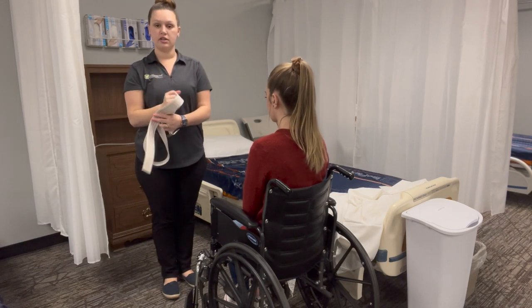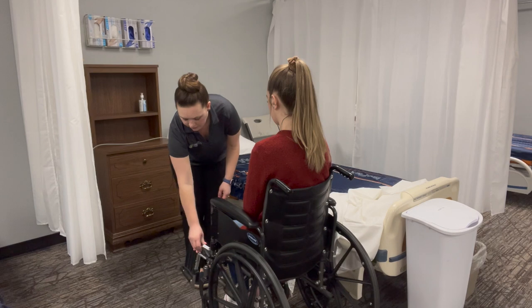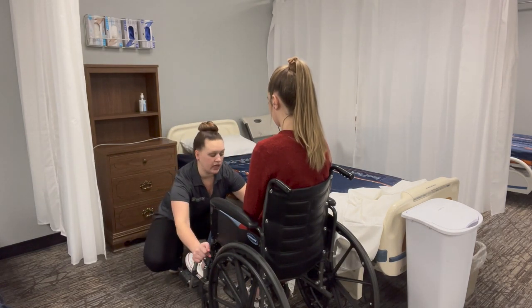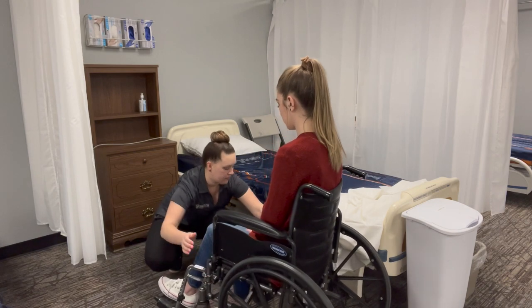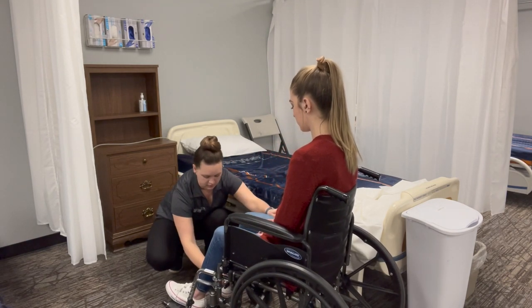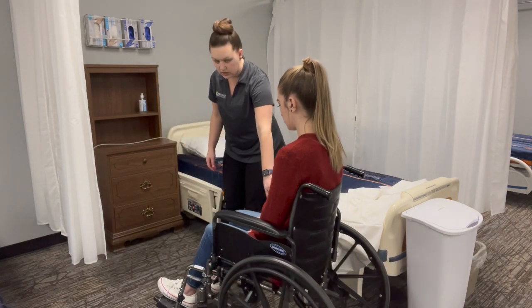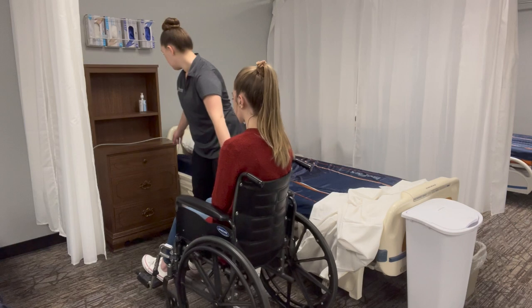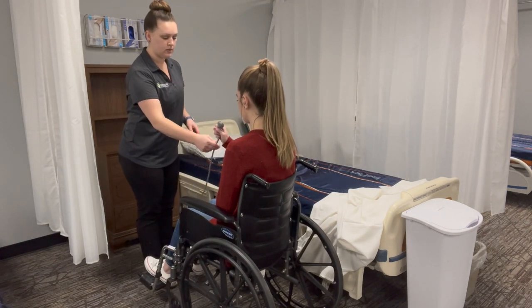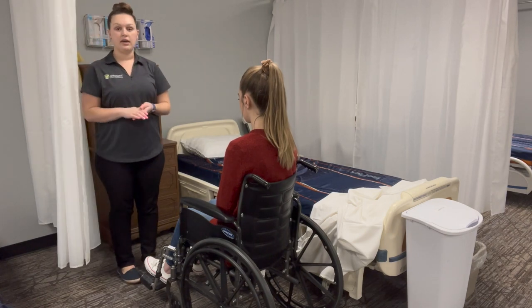We're going to place the gait belt in the dirty supply. We are now going to move the footrests in front and put her feet up on them. We're going to unlock the wheelchair and move her close enough to grab her call light. We're going to wash our hands. Skill complete.